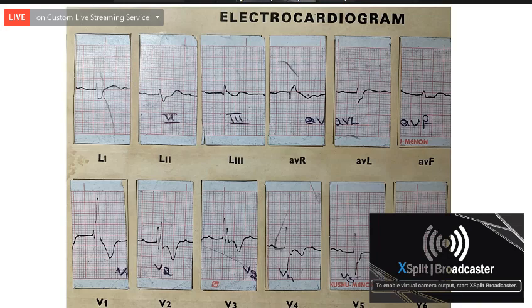We cannot actually call it sinus rhythm because the PR is 240 to 280 milliseconds. How many divisions is it? 6, 7. 7 or 7.5. So almost 300 milliseconds, 0.04 into 7 is 280 milliseconds. Okay. There is an RSR pattern with a QRS duration of 120 milliseconds. It's more than 3 divisions, so it is indicative of a broad QRS complex.